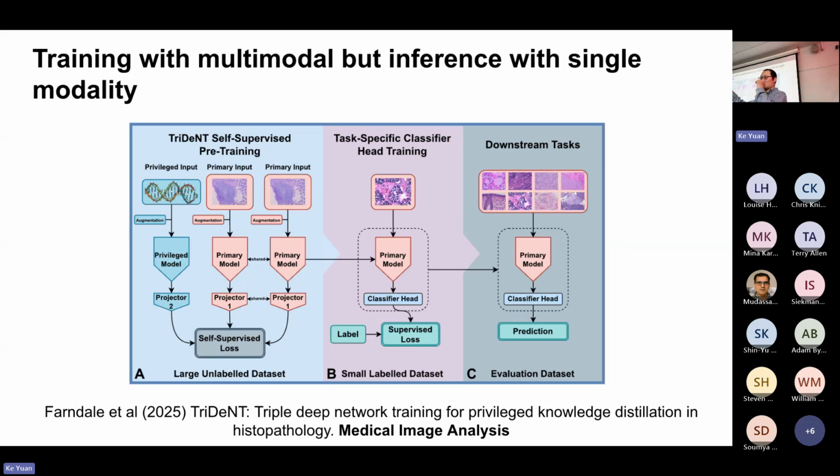So this is almost like a knowledge distillation case, where you're trying to distill information from those high quality, very high content spatial data into a model that can accommodate that information, then find the correlation with H&E appearance, and use that to improve your H&E encoders.